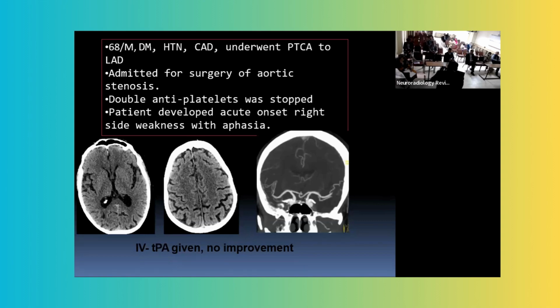My protocol initially in France was to do DW MRI with MRA, but in Pakistan it varies from hospital to hospital.